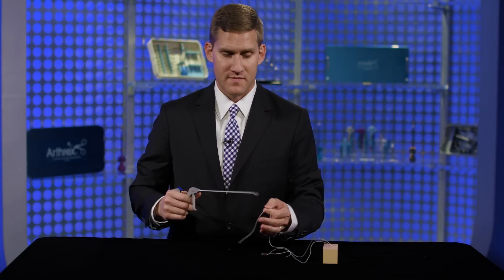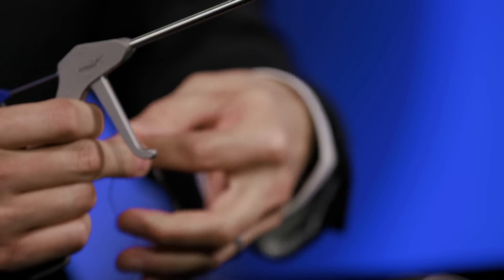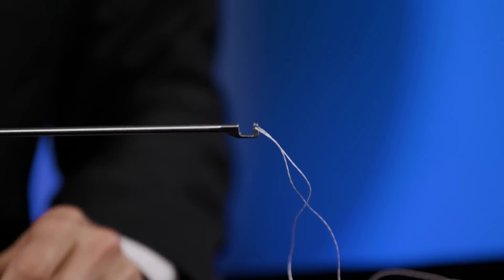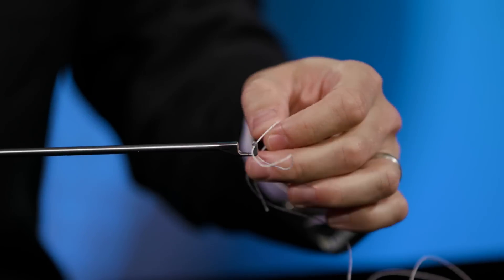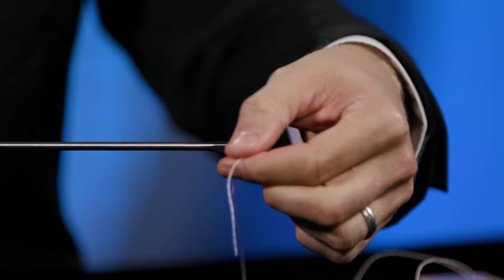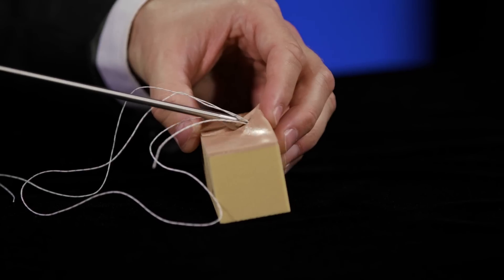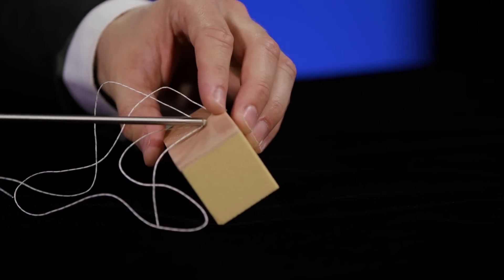Next, outside your portal, you'll load the other side of the suture in the same manner as before. Simply loop your suture and load it in the lower jaw. You'll feel a click and engagement in that jaw to know it's fully seated. You can slide to control how much suture you want through the lower jaw. You'll then slide that back down your portal and grab the other side of capsule that you want to close to bring together.